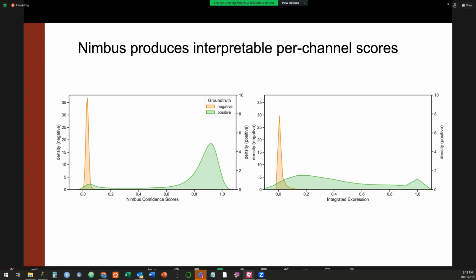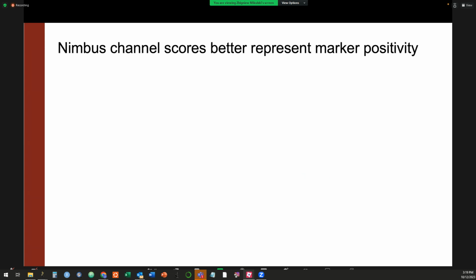Whatever your favorite clustering algorithm is, or clustering algorithms that are being developed, when you're starting from the extracted counts per cell, this is what you have to work with. And so it's a much more challenging problem to even understand on a single channel level, let alone a multiplex level, what it means for a cell to be positive when your data fundamentally does not reliably communicate what we can see by eye when we look at an image.